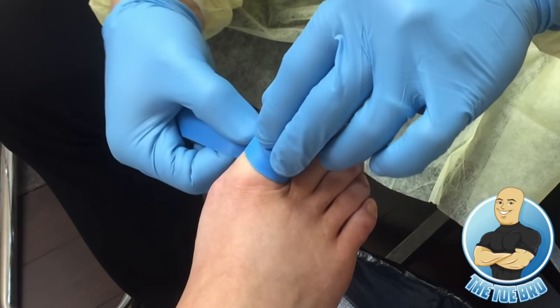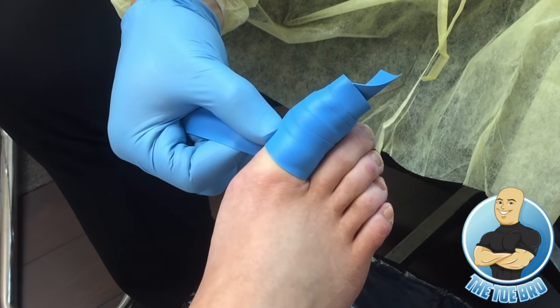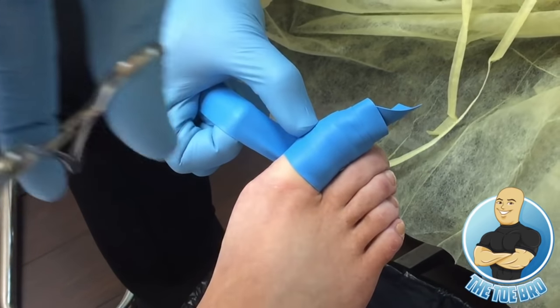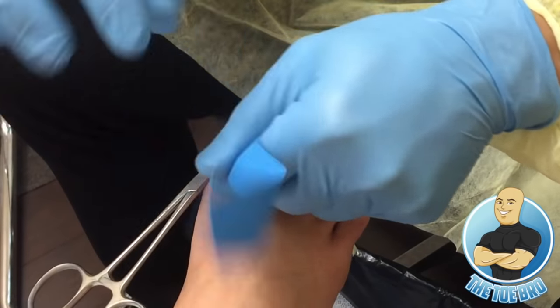And why am I putting on this tourniquet? There's really three main reasons. One, blood loss. We want to minimize the amount of blood loss during the procedure. Some people are on blood thinners, some people tend to bleed a lot. This will stop that.